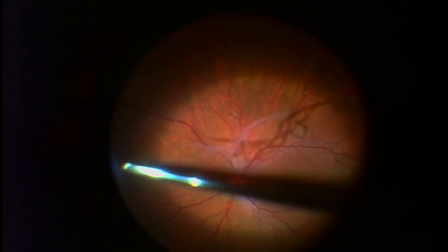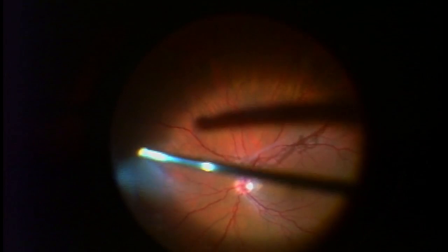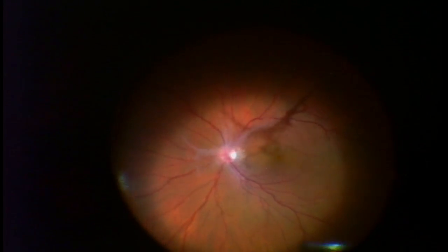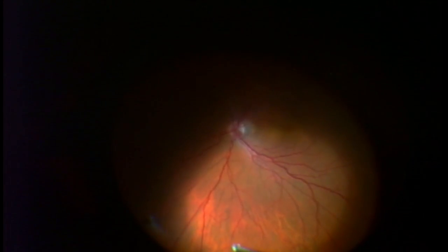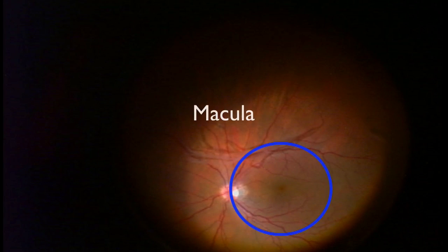What I like to do is go off to the side and move in a circular fashion around the eye. I don't necessarily go right after the opacity itself. As she has had a PVD, the opacity will actually come to my instruments. So it makes the removal of the vitreous very efficient both in time and with regard to the amount of vitreous I'm able to remove.